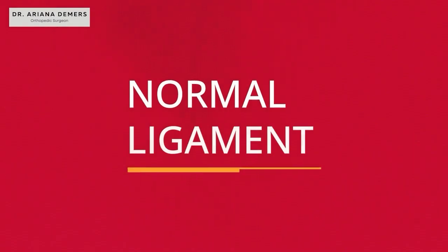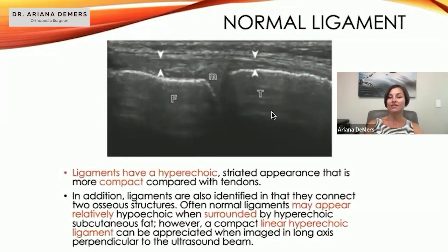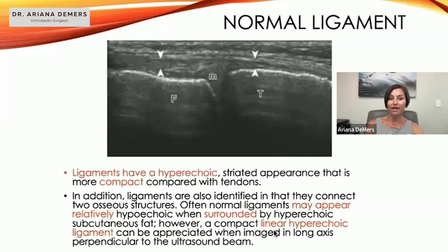This is ligament — a bone-to-bone connection. This is femur and tibia, and this is an MCL. It looks similar to tendon and is hyperechoic, but it's a little more compact than tendons, as you would expect. A compact, linear, hyperechoic structure running bone-to-bone is ligament.